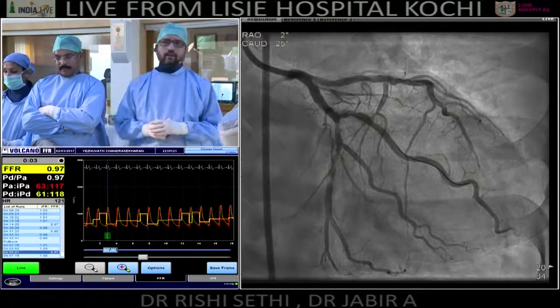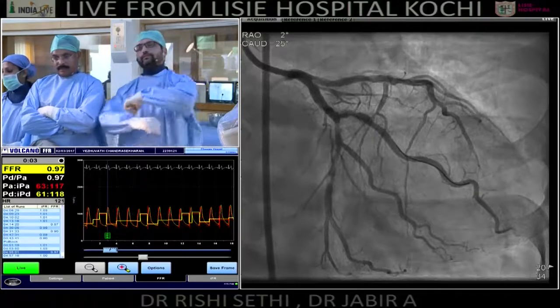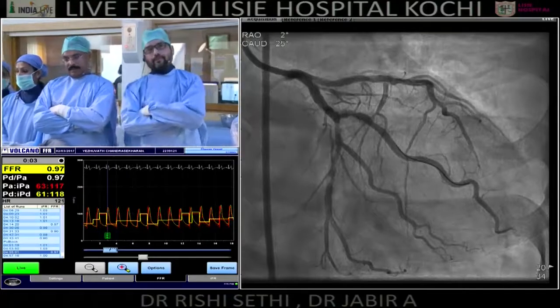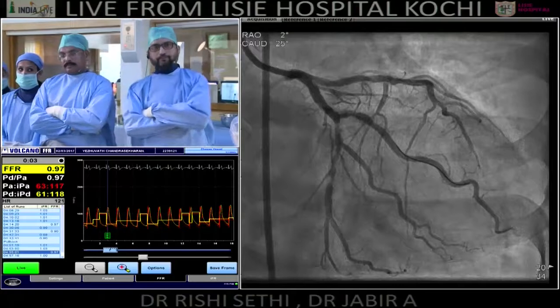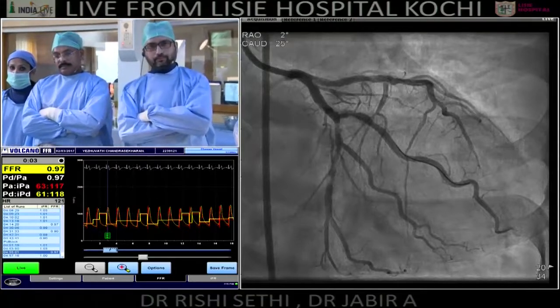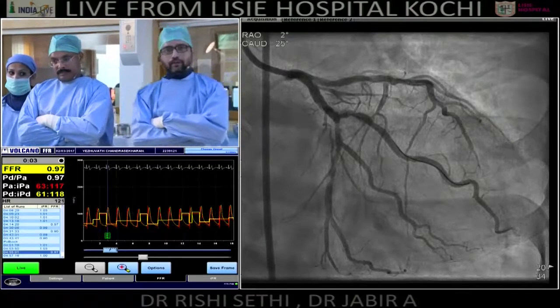So anyway, having said that, the FFR, the IFR also has certain gray areas, as you pointed out. Yeah. And the validation for IFR is not as great as for FFR. There are validations now, but they're not as great as for FFR. So when you land up in these, I don't think you can take IFR as an absolute standard as yet. You can use it. It's going to get better. But you have to validate it with an FFR, and you did that.